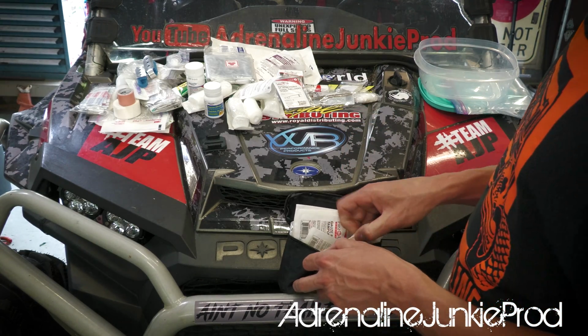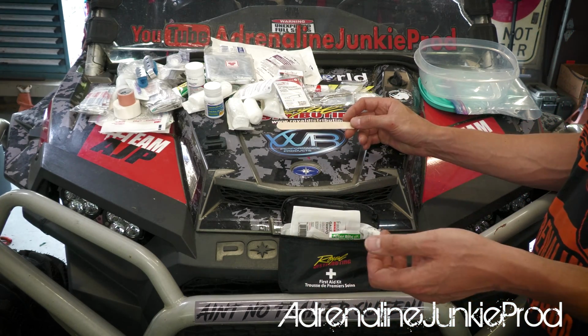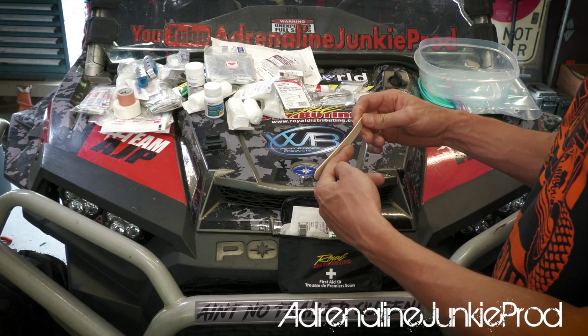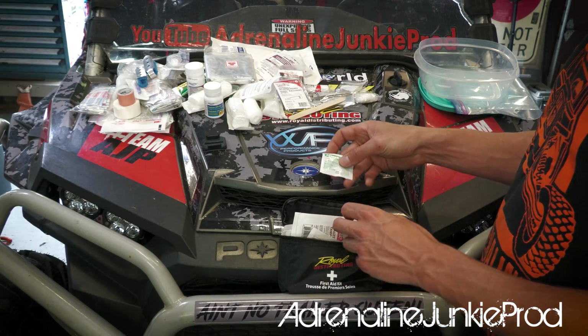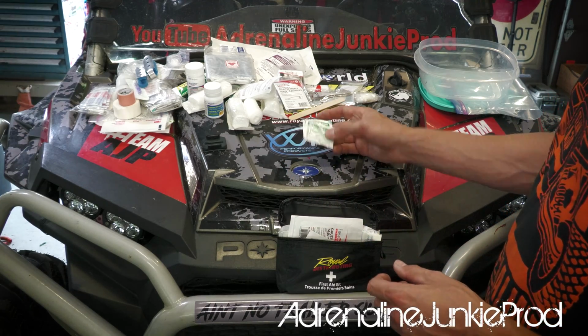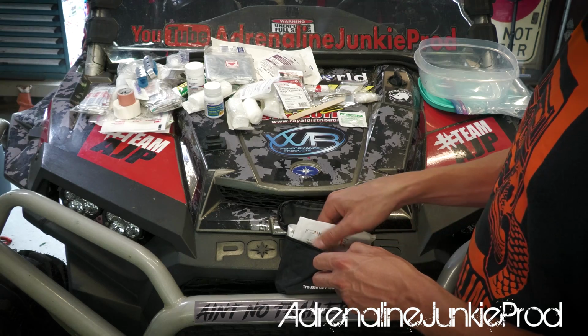What else do we have? A tongue depressor. This is one of those, like, it's in there, whatever. Yeah, sure, if you wanna examine someone's airway, great. If you wanna make a little splint for your finger, great. It is handy, it's good to have. Oh, afterbite, like we were talking about. They've got some afterbite in here, cool. So that's kind of like our Benadryl stuff. That's a smart addition.